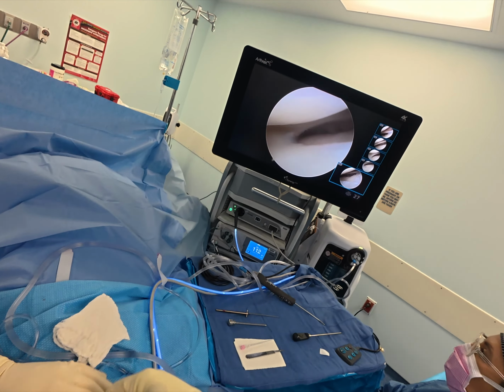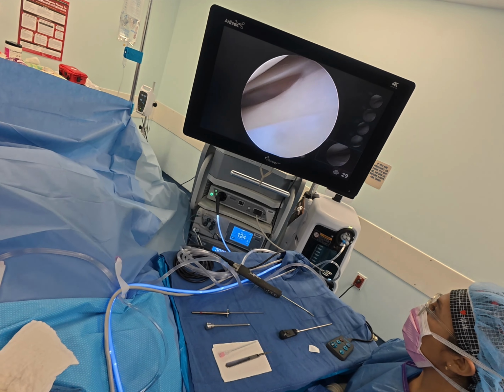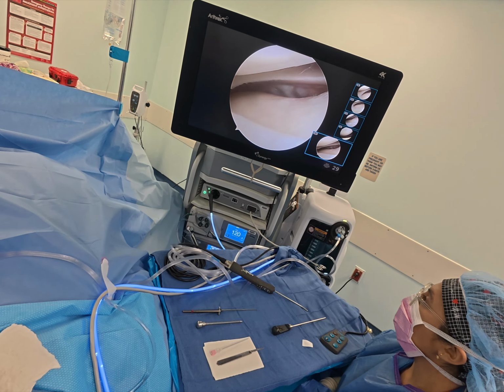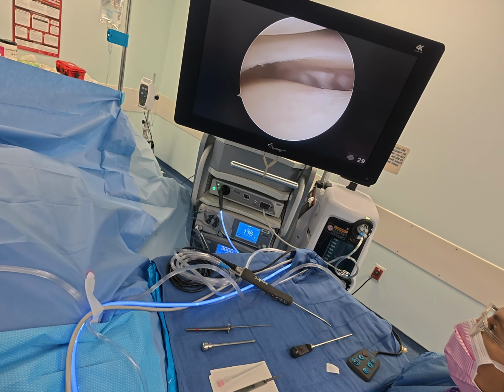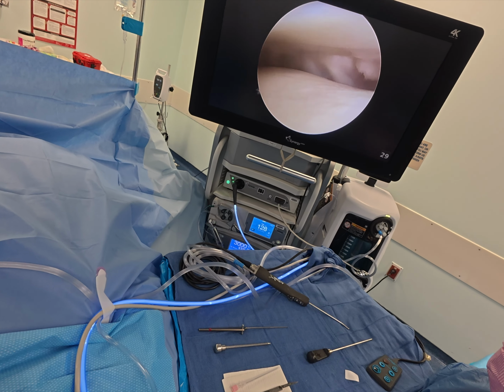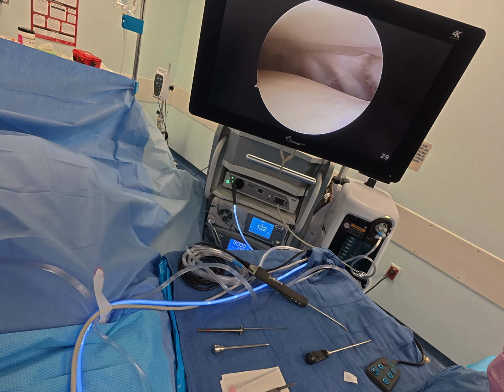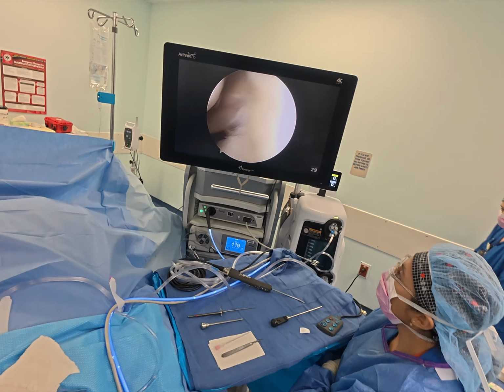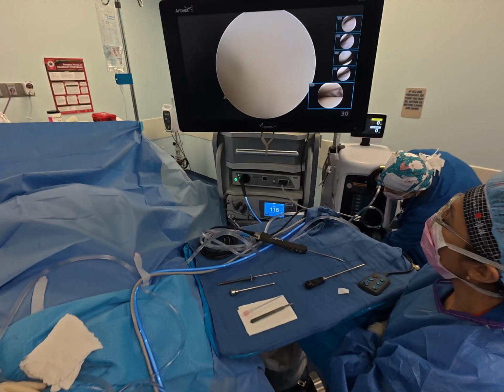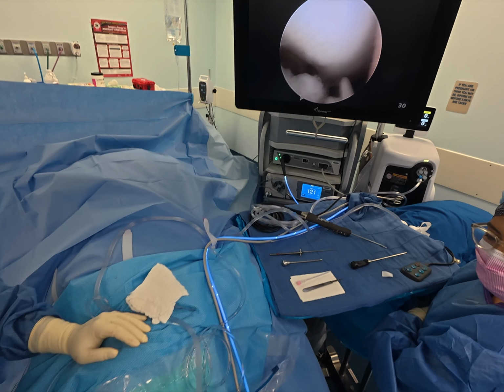So thus far, the only pathology we've really seen is the patellofemoral arthritis and the medial patello articular facet. In the back there, open and close, you see the popliteus tendon, this white tendon underneath right there. That white tendon is called the popliteus, going through the popliteal hiatus. And at this point, we have to find that synovial tumor. So let me have an 18-gauge spinal needle.